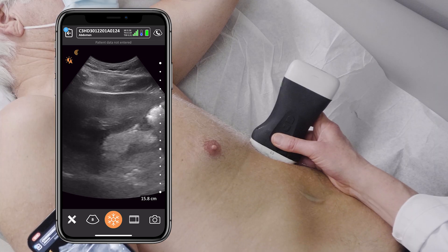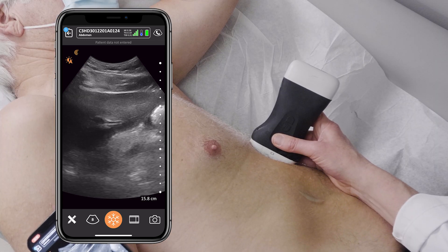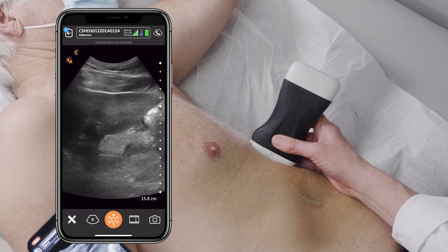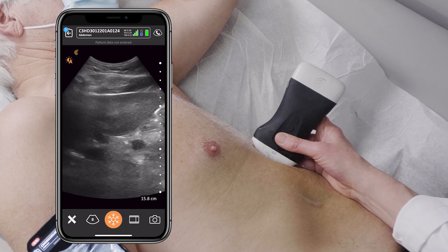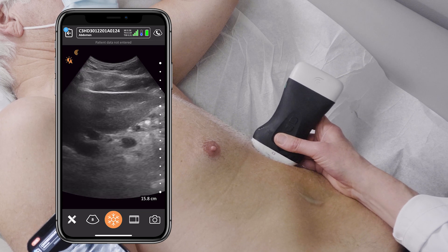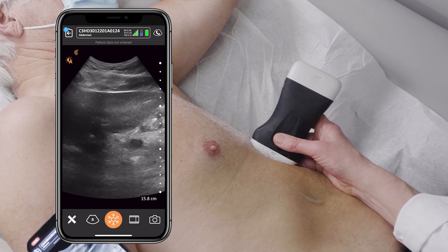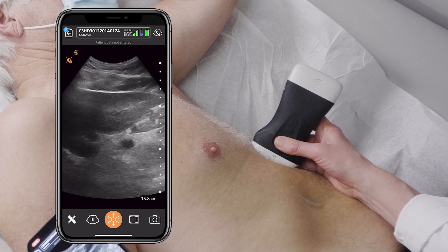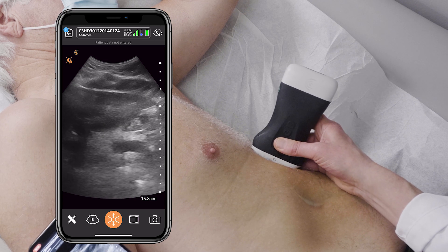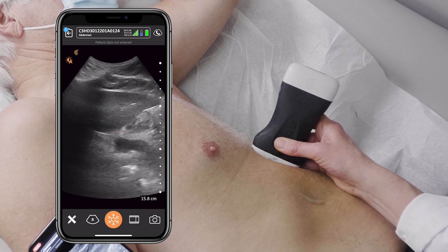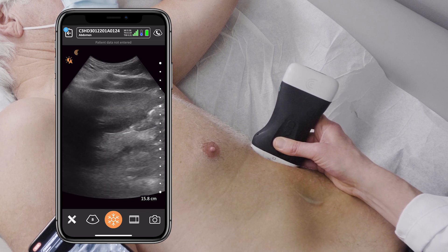I'm starting with the patient in the left lateral decubitus position and my pointer is pointing towards the patient's head, with the probe in sagittal section, or what we call longitudinal.